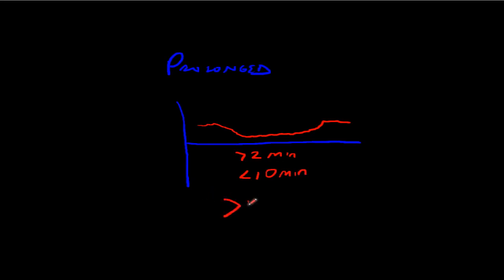Anything that's greater than 10 minutes is going to equal a change in baseline, and really should be described as such.